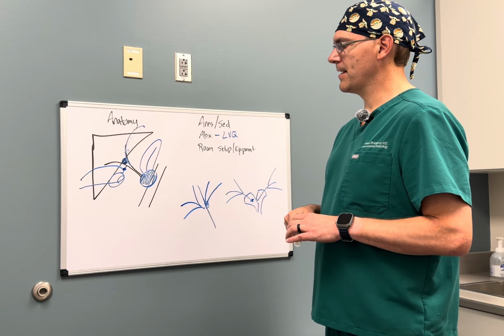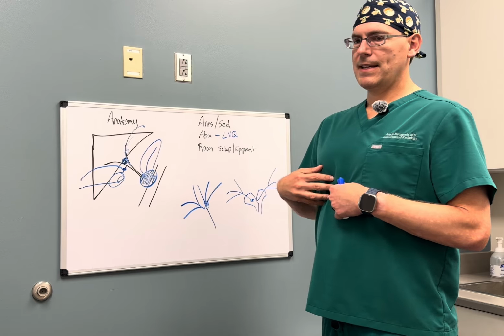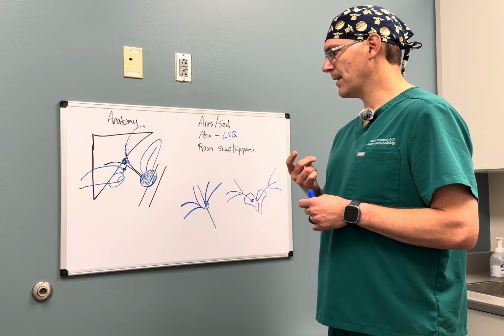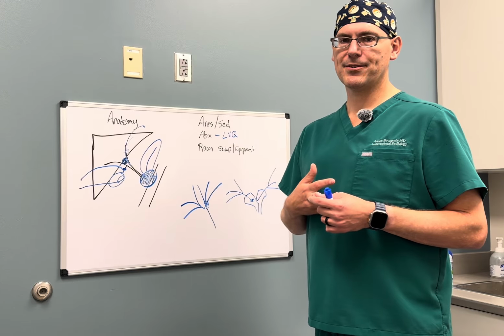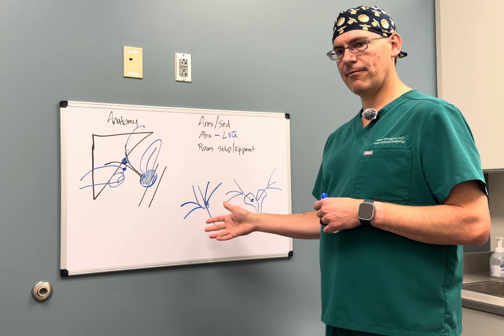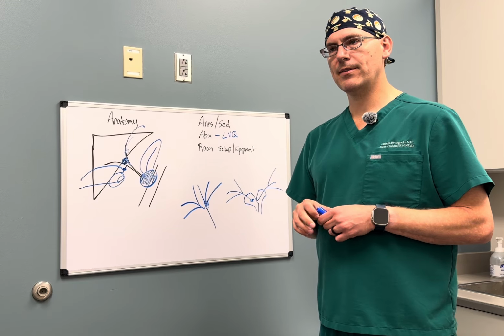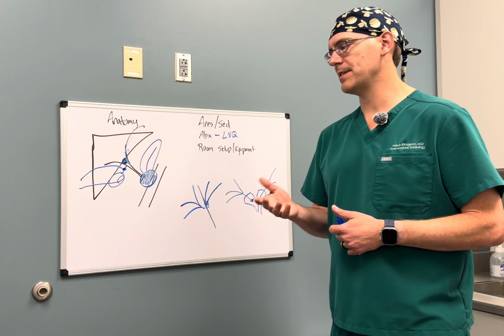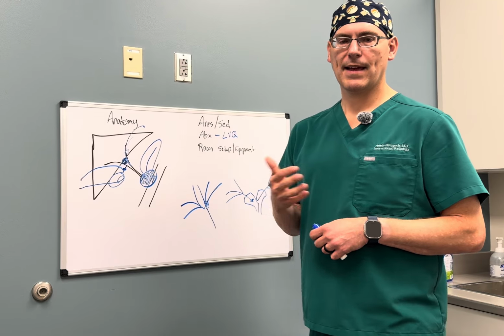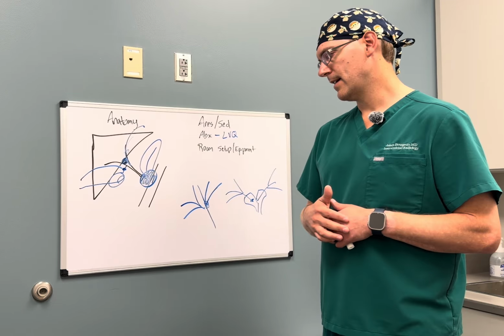Lastly, in terms of room setup, we like to mark these ahead of time to make sure that we're prepping the right location. I plan for a 10 French biliary drain, the exception being when there's a really tight stricture and I can't advance the tube. Even though I plan for a 10 French drain in most of these situations, we tend to not drop a tube ahead of time. We make that a game time decision once we get in the ducts.